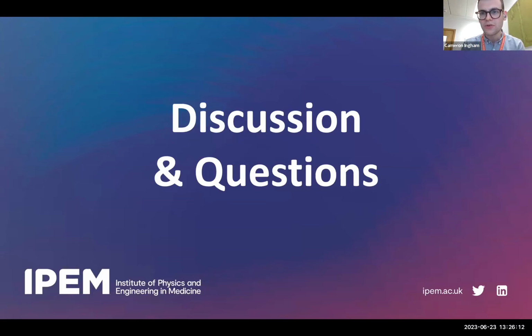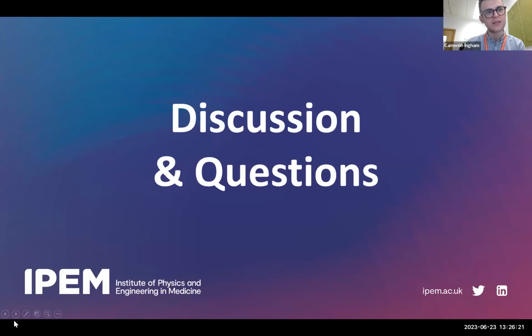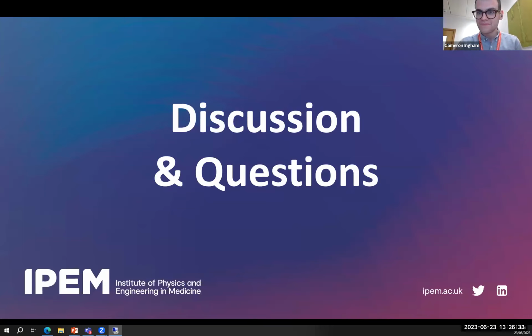Good question by Jonathan. Given the oversampling and Grappa limitations on DR Boost of the body, is it worth focusing on this as an image quality aid rather than a time-saving aid? So maybe that's just a general question about what your attitudes are to using DR Boost as an image quality improver rather than a time saver. That's true. I've spoken to a few of the people who have the software now, and a few sites are actually using it to boost their SNR and get better image quality, even though it was purchased to achieve shorter sequences. So there's definitely that option out there.